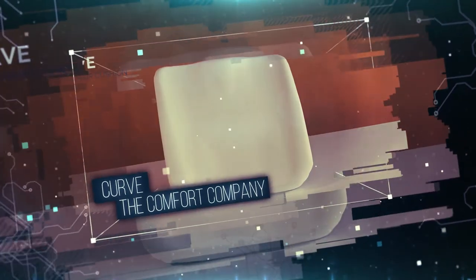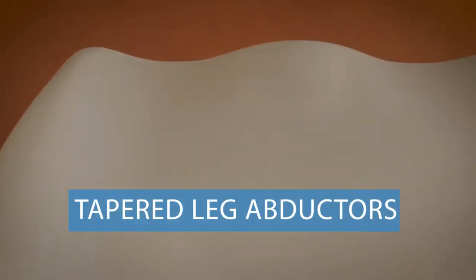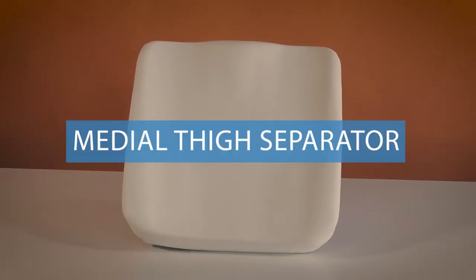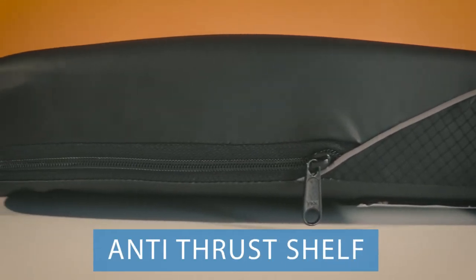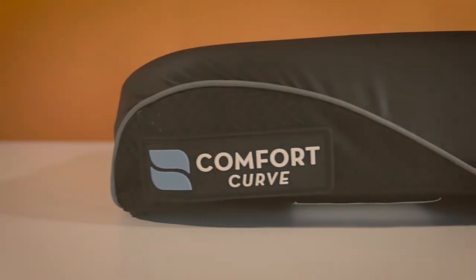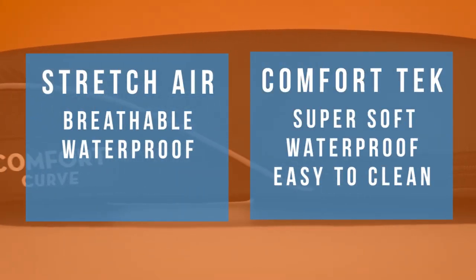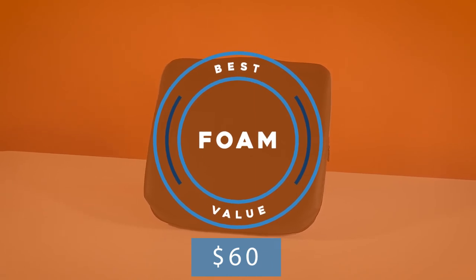Coming in at number two on our list is the amazingly comfortable and affordable Curve Wheelchair Cushion from The Comfort Company. Tapered leg abductors get wider towards the back of the cushion to support your hips, a medial thigh separator helps support an upright posture, and a mild antithrust shelf provides additional stability. Two different cover options from The Comfort Company round out a seriously stylish cushion that, for just $60, earned our pick as the best value in the foam category.